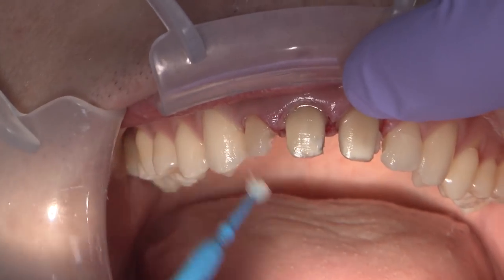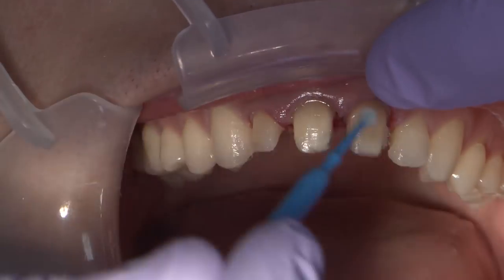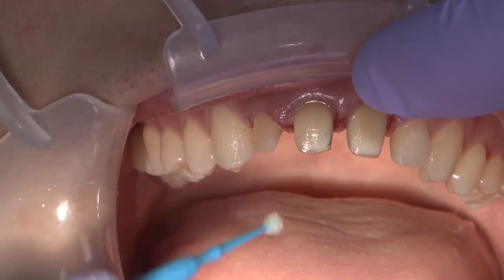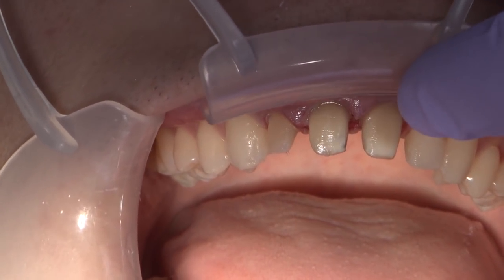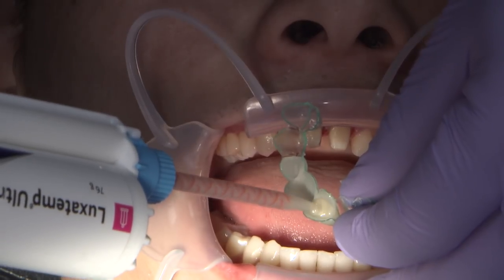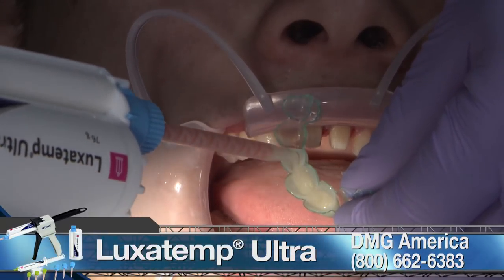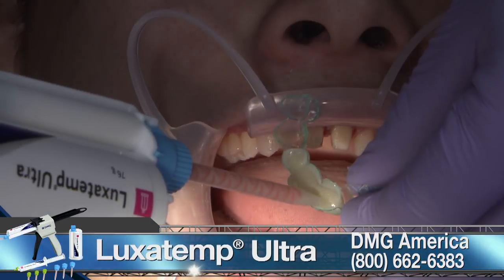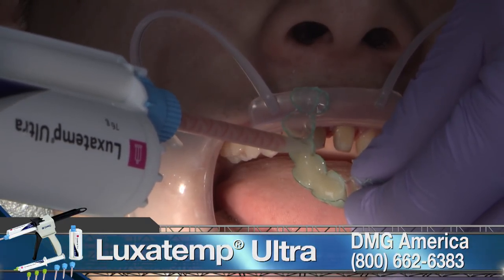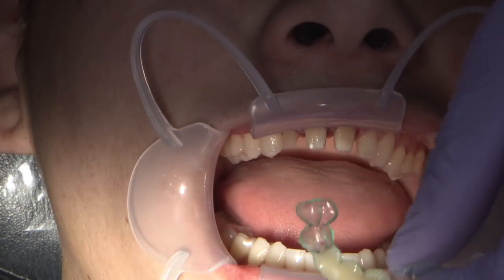My first example involves a young man with three endodontically treated anterior teeth. Before any temporary is relined, I swab the preparations with a smear of Vaseline to prevent acrylic adhesion. The BioTemp has been nested into the plastic Fast Stent, and the acrylic reline can now be extruded. I place a small drop of acrylic on my glove so that I can monitor the curing process without disturbing the reline.